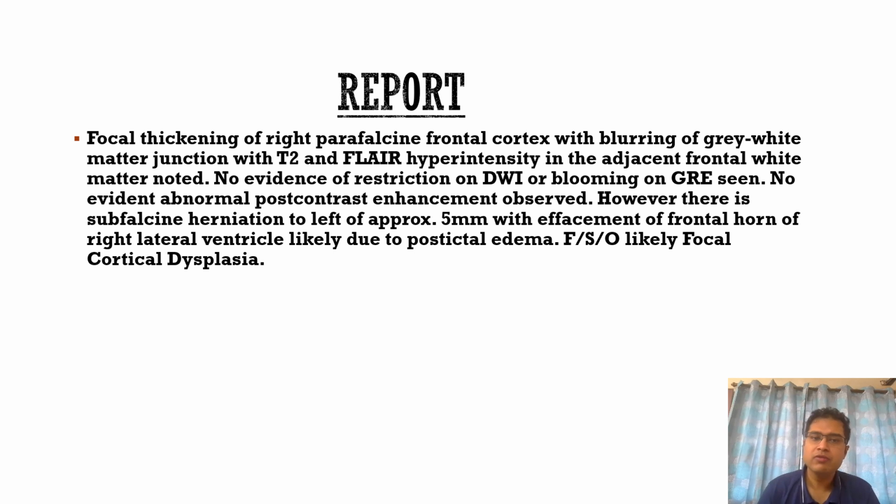etiology. However, there was subfalcine herniation to the left of approximately 5 mm with effacement of the frontal horn of the right lateral ventricle. It was likely because of the postictal edema. Features were suggestive of a focal cortical dysplasia.